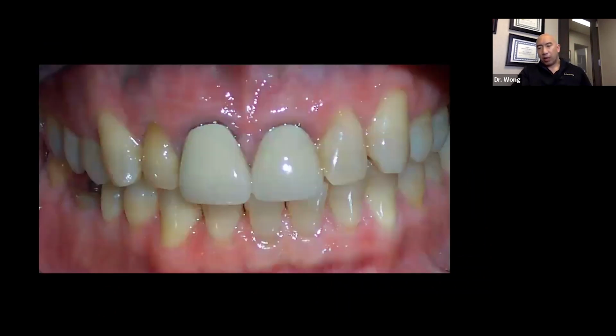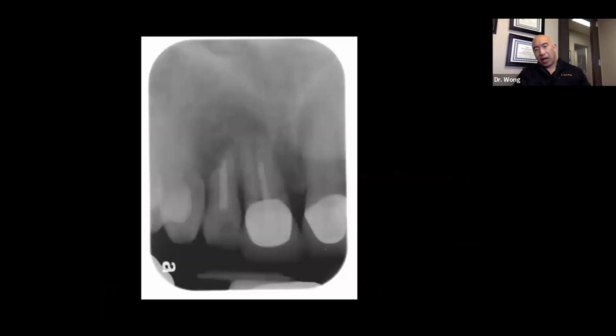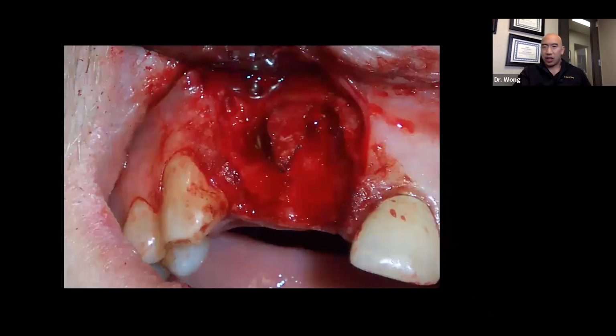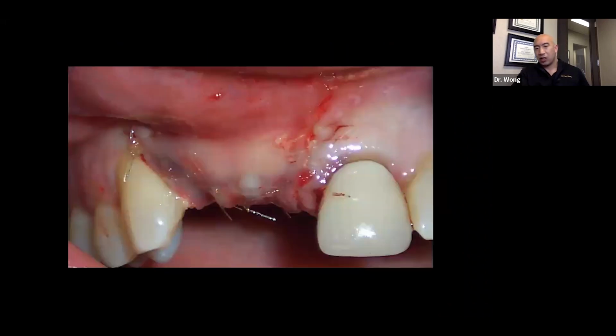So where we're headed now, and what we're about today, is how do we take these types of cases where, if you look above number 7, there's that fistulous tract up there, and when you take the teeth out, you can see that we've got blown out facial plates. This is the goal, is knowing what to do when we're presented with this type of case, not necessarily being aces at it the first time we try it, or maybe not even the second or third or fourth time we try it, but eventually learning to master this technique, or at least knowing, maybe this isn't for me.